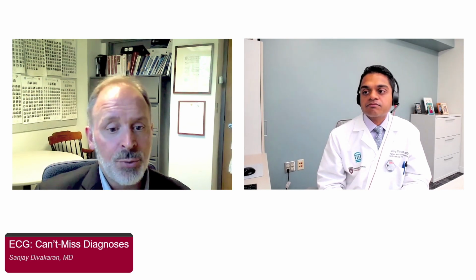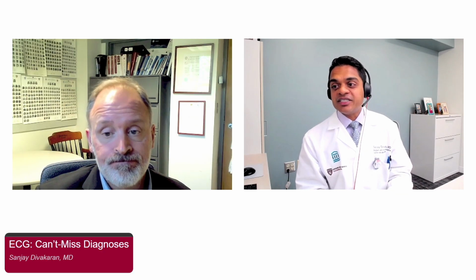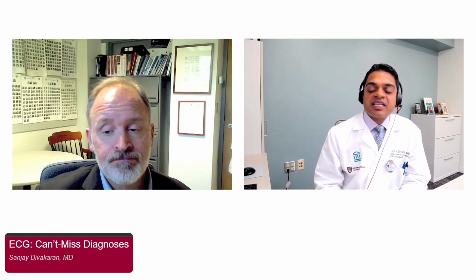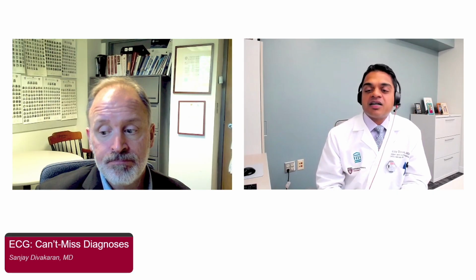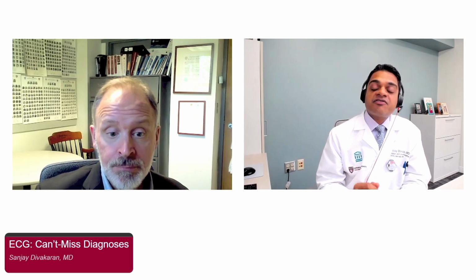Okay. Do we need to worry about QT prolonging meds in patients who are permanently paced? Yeah, so the answer to that is yes, you still do need to worry about that. There is less of a worry because a lot of the QT prolongation is from the QRS. So as long as you adjust for that, you should be okay. But even after adjustment, if you do see QTc prolongation, there is still a concern of having an abnormal QTc.